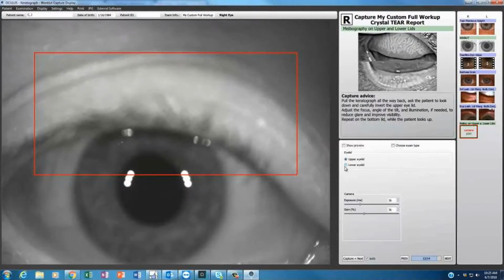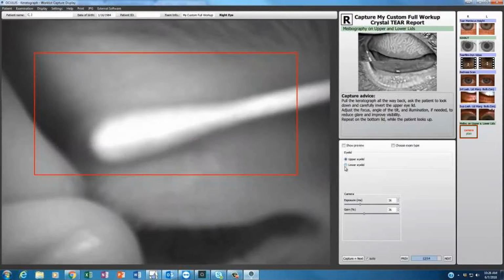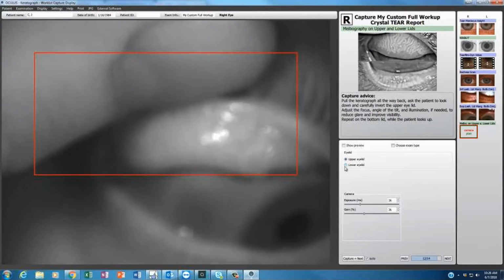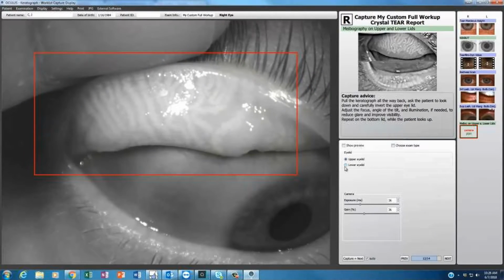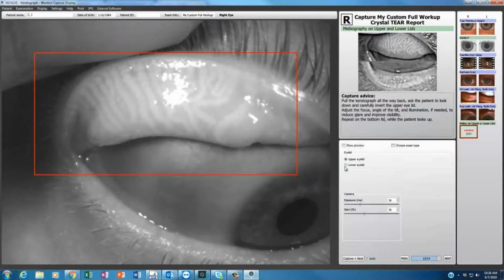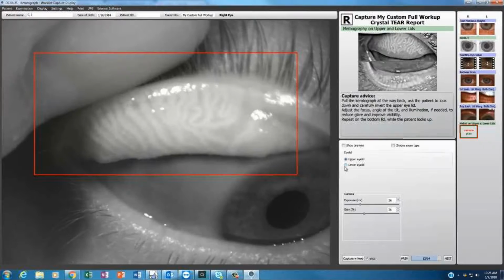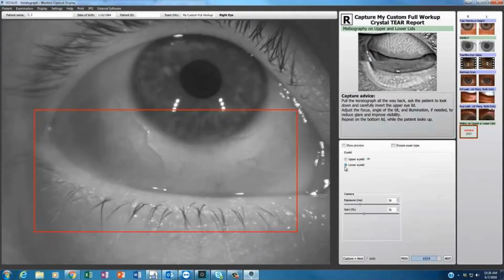Now that it's done the right and left on all those exams, it's going to go for meibography in the end here. They just need to know what to focus on for each test. They need to know what they're actually trying to hit. So they need to understand it, but they don't need to set it up. It's like you were saying, you've got to focus on different spots for each thing. And like, they're trying to get the glare gone. Don't just take a picture as soon as it's flipped. Quality of what we're looking for.